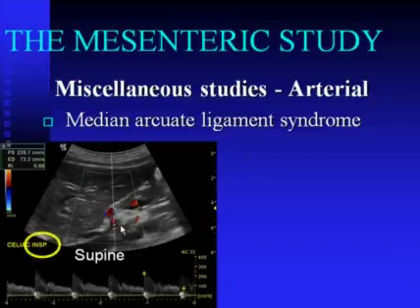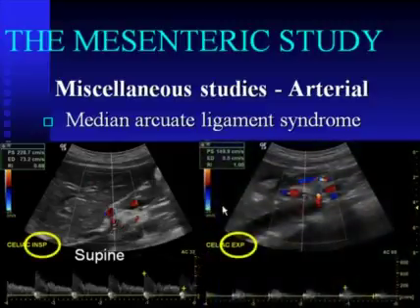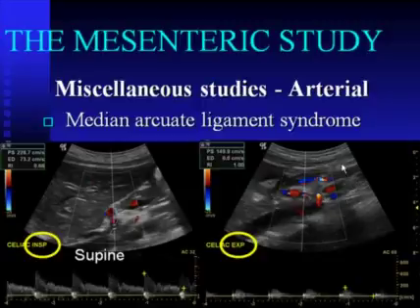When the patient then exhales completely and the liver and spleen are pushed farther up in the abdomen as the diaphragm raises, we see the celiac is also pulled upward. You can see how it has changed its course from inspiration to exhaling, the crimping that goes on right here, and in fact here it is so severe we have almost lost all celiac flow.